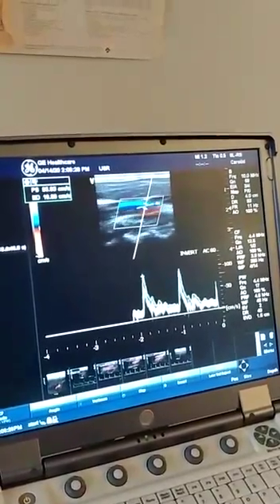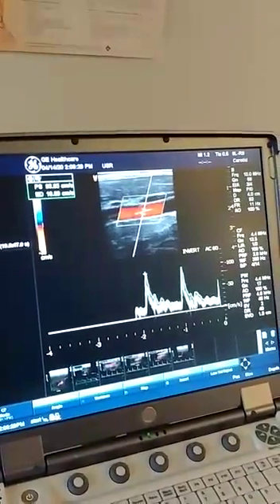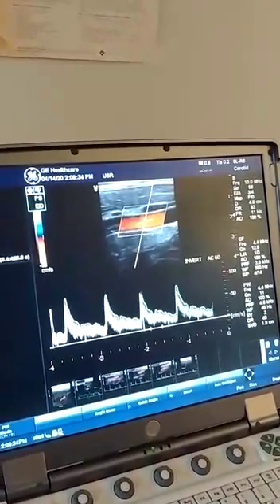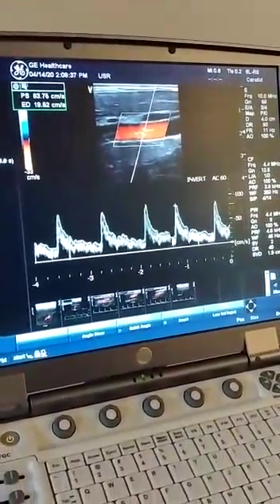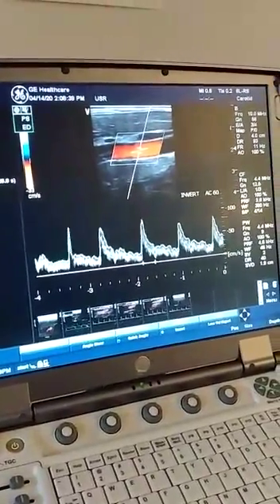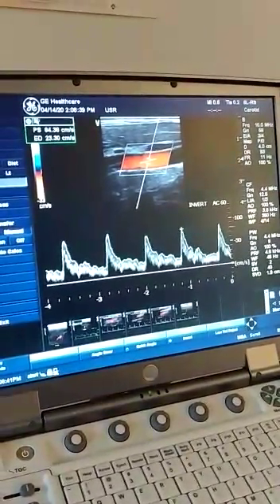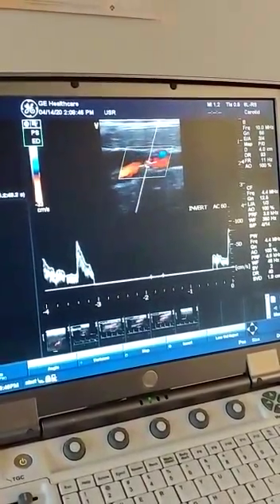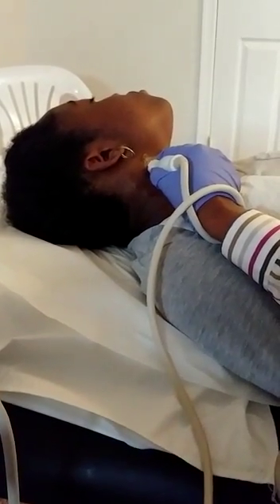I'm going to go up into the mid-segment of the CCA and I'm going to turn my Doppler gain down a little bit to keep the laminar flow. That's your mid-segment. Then I'm going to go further up towards the head into the distal CCA, and I'm going to go ahead and store that image as well. That's my distal CCA.